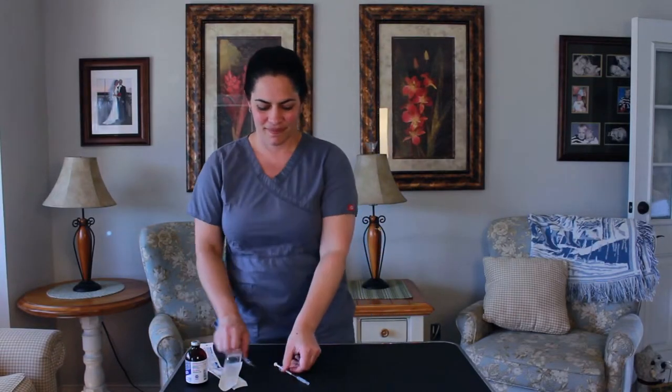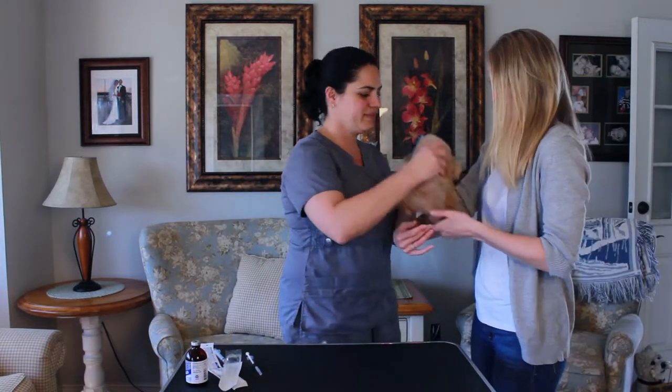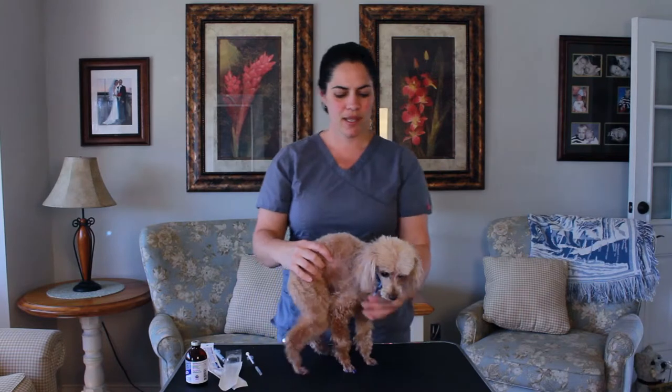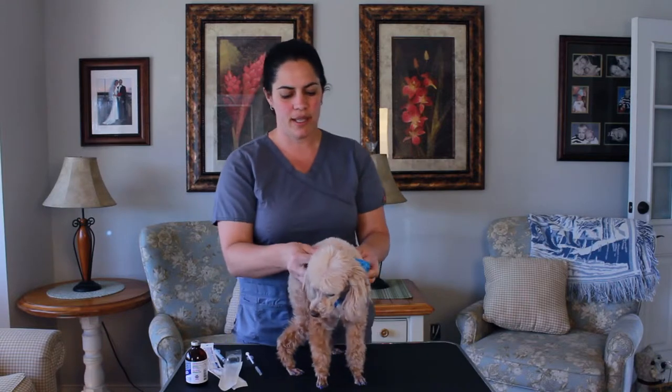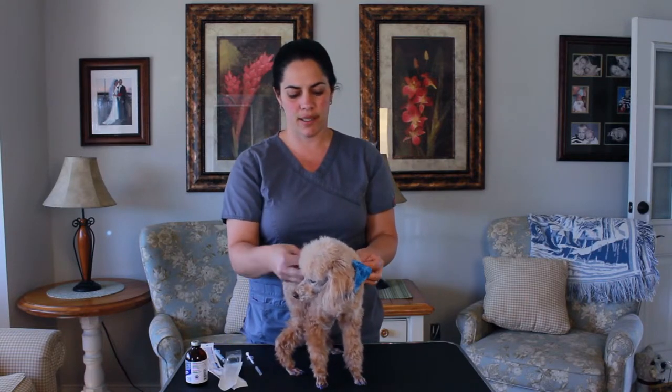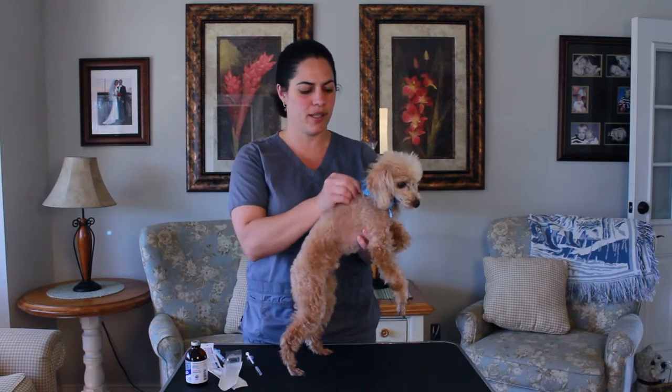Now we're ready to give our shot. This is our lovely Poodle, Vanna Poodle. When you give a shot, the best place to give a sub-Q shot is actually over the thorax, the sides of the body. The reason is that it gets absorbed quicker and there's less fat. Poodle is actually very skinny, so I think we could go pretty much anywhere.